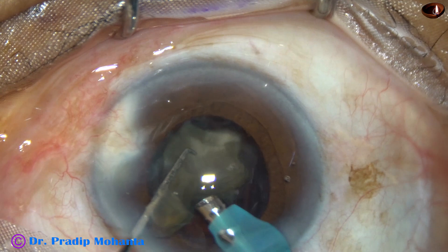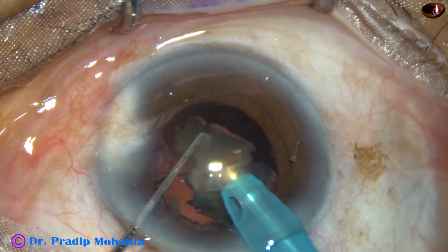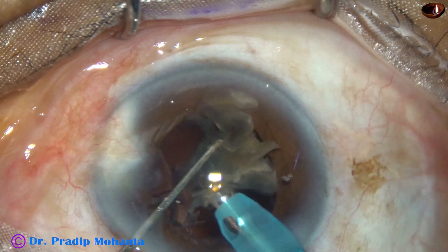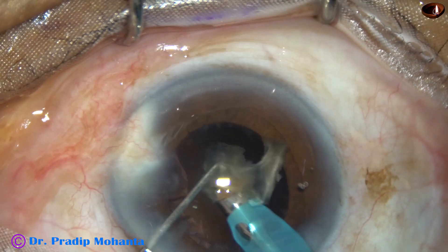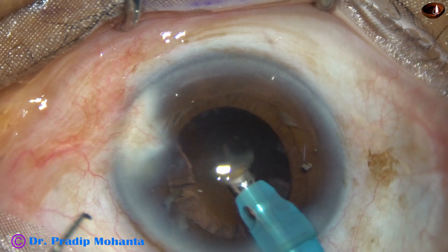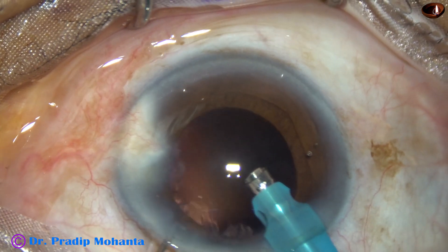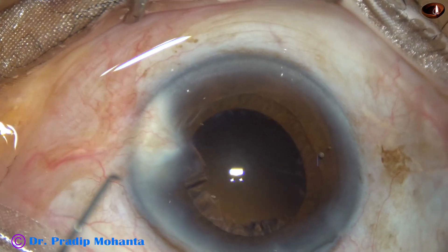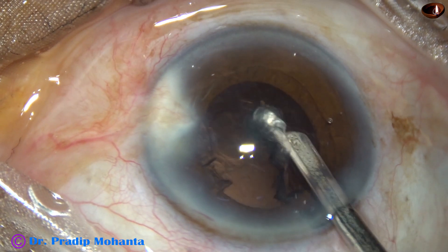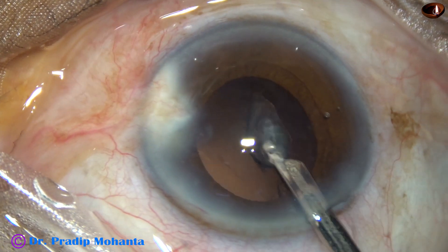Friends, in this case the anterior chamber was very stable — there was no surge. The posterior capsule was far behind. At this time I am in SPIP mode, where we can control the vacuum when the tip is occluded. This is a very safe software. The nucleus and epinucleus have been managed.